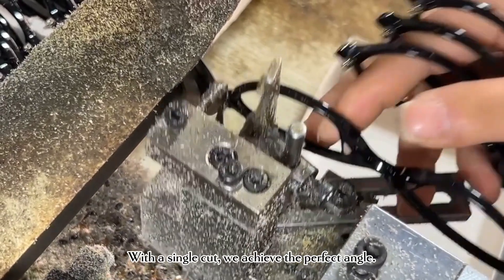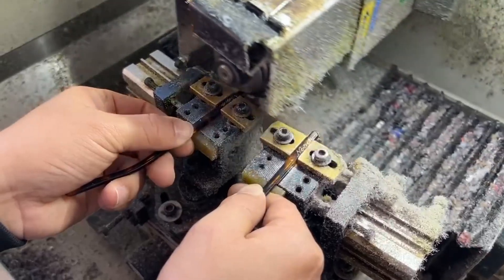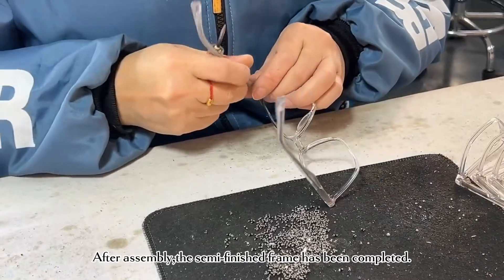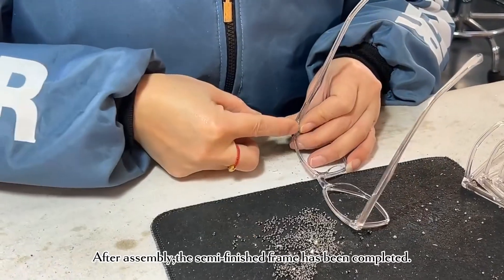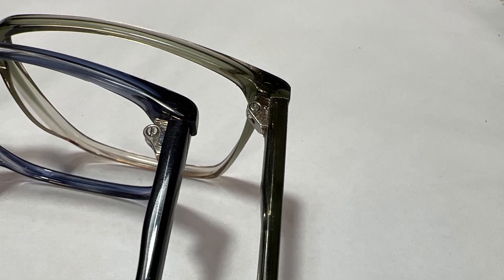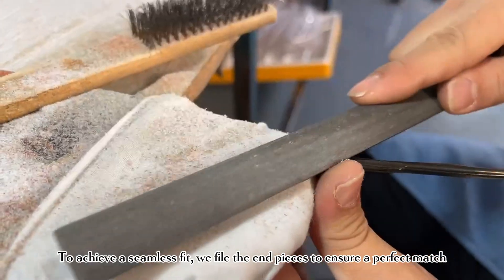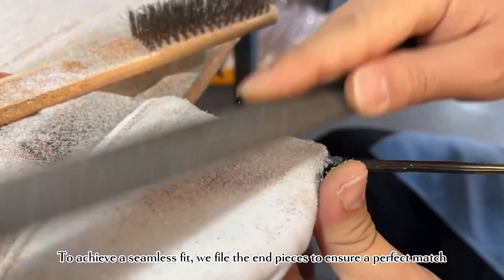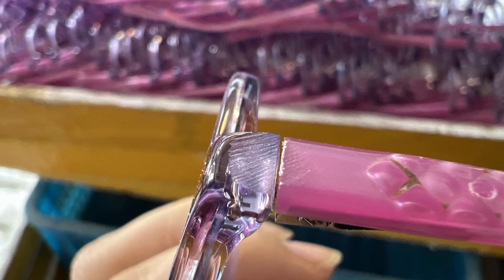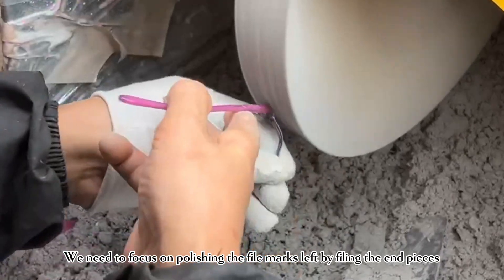With a single cut we achieve the perfect angle. After assembly, a semi-finished frame has been completed. To achieve a seamless fit, we file the end pieces to ensure a perfect match. We then need to focus on polishing the file marks left by filing the end pieces.